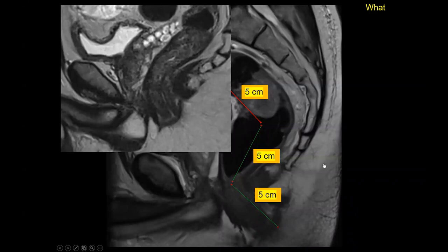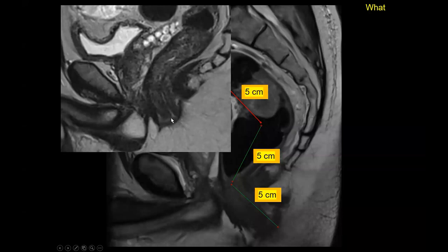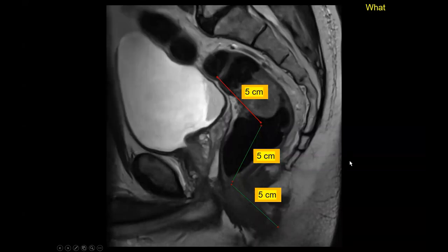The anal verge is typically defined by where the external sphincter ends. The external sphincter extends slightly lower than the internal sphincter, so some institutions use the most distal part of the internal sphincter and others use the most distal part of the external sphincter — a difference of only about 0.5 centimeters. The key is to talk to surgical colleagues and oncologists in your institution to agree on the definition, but ensure the 15 cm measurement from the anal verge is used.